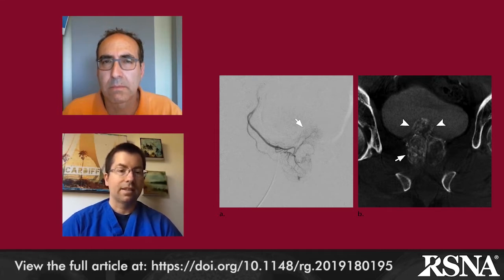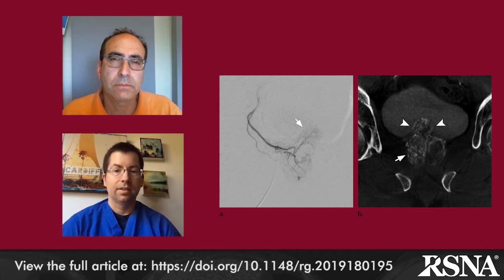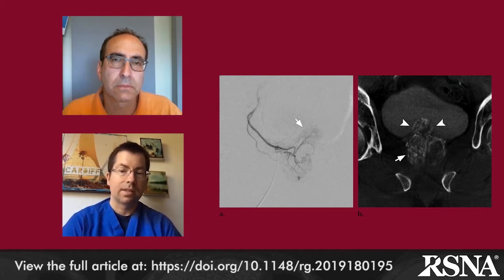The microcatheter is advanced into the prostatic artery, the balloon's inflated, and then this balloon protects from reflux along the catheter to prevent particles from entering proximal non-target branches. But it's also thought that the balloon has an effect distally in the prostatic arterial bed. Once the balloon's inflated, there's decreased pressure distally, and it's thought that this decreased pressure could then reverse flow within small collateral arteries. So you get an effect where there's reversed flow in small collaterals now coming towards the prostate. So it's thought this may provide a second mechanism to prevent non-target embolization during treatment.